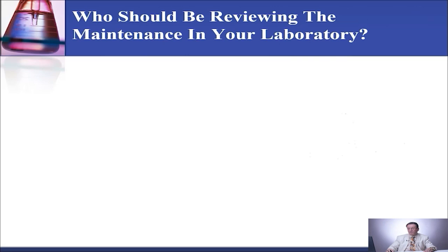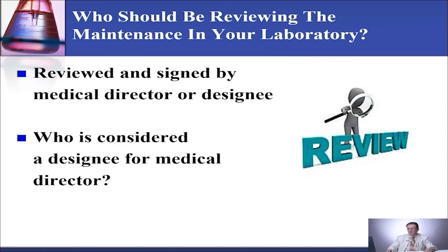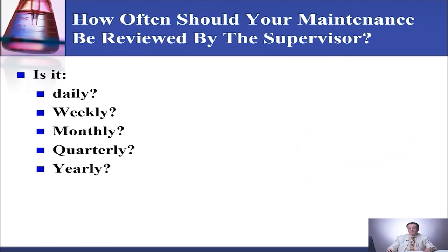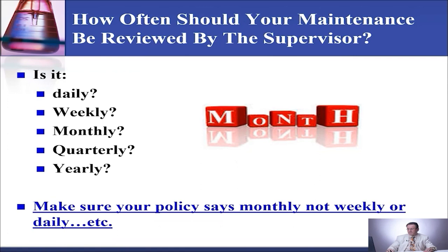Who should be reviewing the maintenance in your laboratory? It should be reviewed and signed by the medical director or the designee. A designee for the medical director for maintenance and QC can be the supervisor or the senior, but it needs to be delegated in writing. How often should your maintenance be reviewed? At least monthly. You need the medical director or designee to be reviewing the maintenance and dating it at least monthly. Make sure your policy says monthly, not weekly or daily. If you put in your SOP that you are going to review it weekly or daily, then you have to comply with it, otherwise you will be cited.